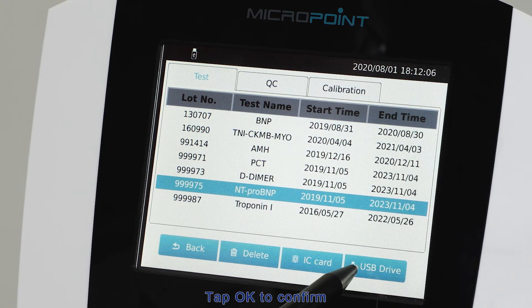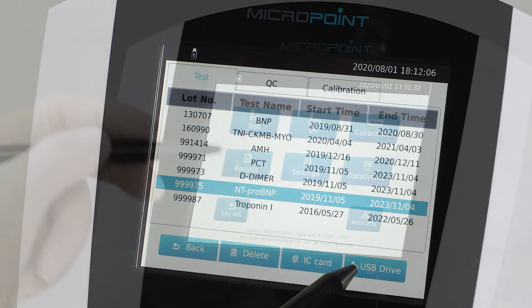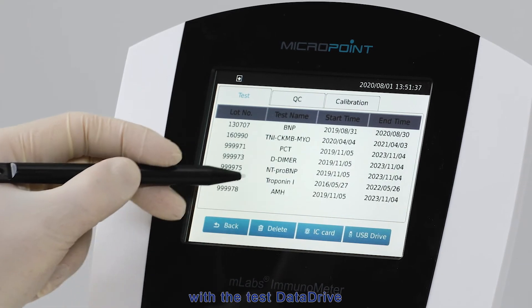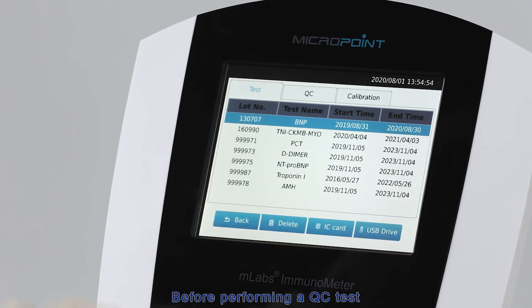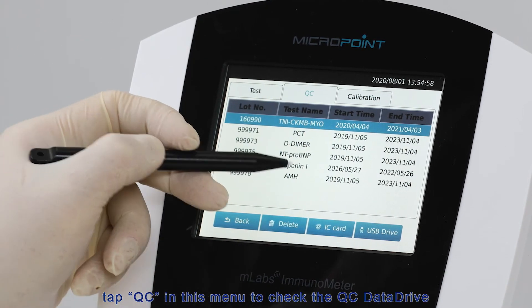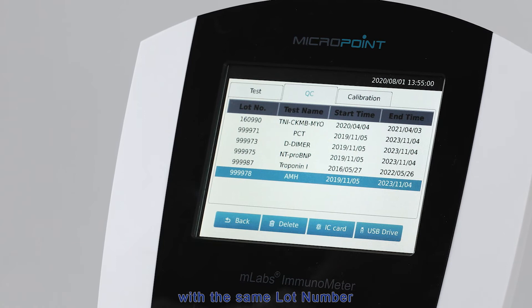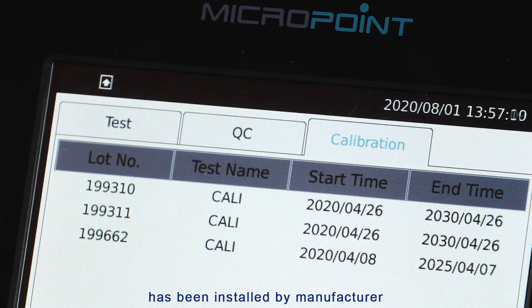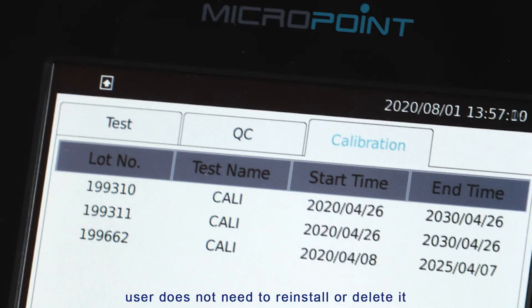Tap OK to confirm. All installed data drives will be listed in the menu. In most cases, the corresponding QC data drive is installed with the test data drive. Before performing a QC test, tap QC in this menu to check the QC data drive with the same lot number as those in the test data drive list. Remove the USB disk or IC card from the M-Labs Immunometer after installation. Calibration data drives have been installed by the manufacturer — users do not need to reinstall or delete them.